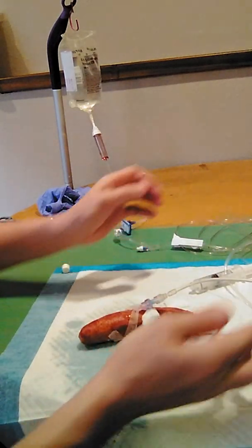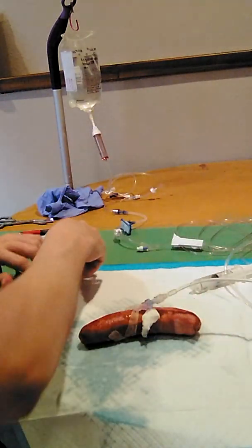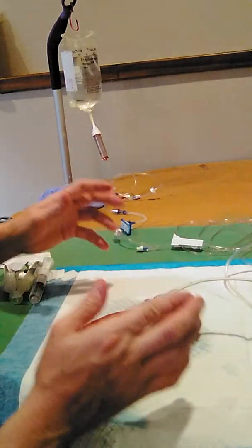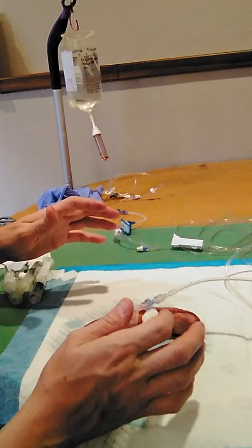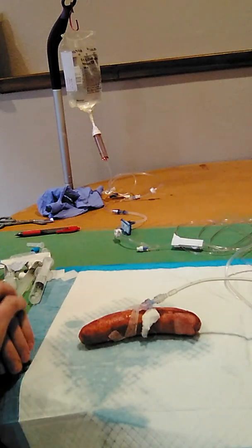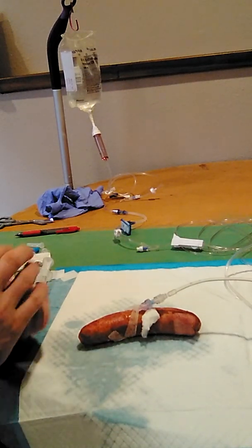And now I will dispose of the equipment using sharps when necessary. And my goal is to leave the patient in a safe, comfortable position, bed at its lowest height, call device within reach of the patient. And that concludes the section of IV push medications through a saline lock.